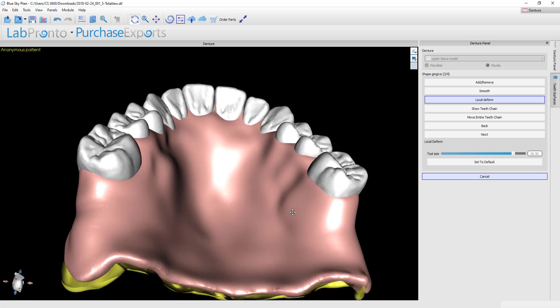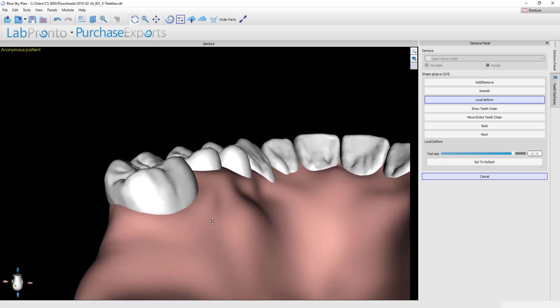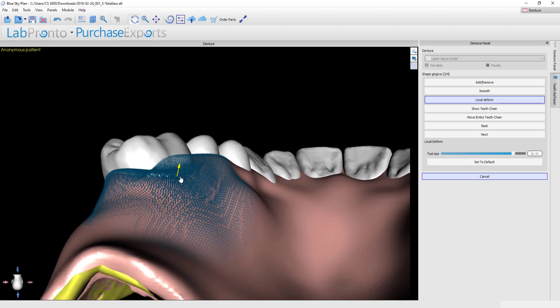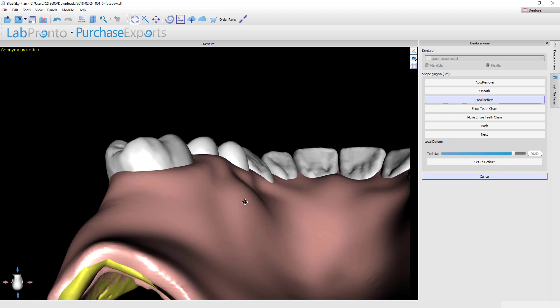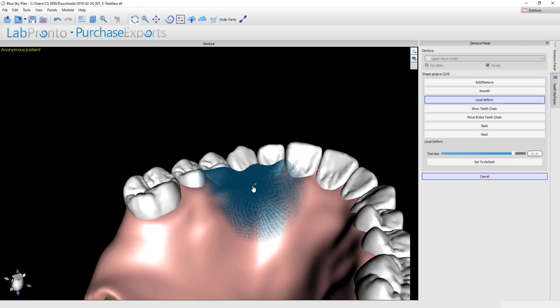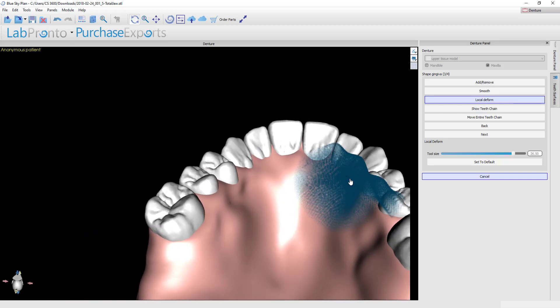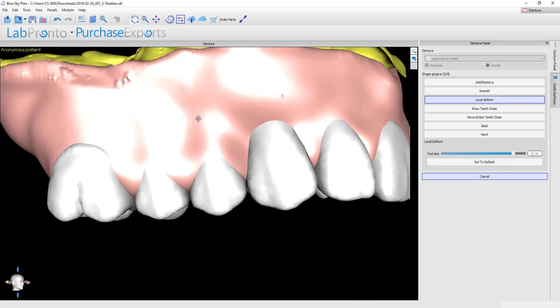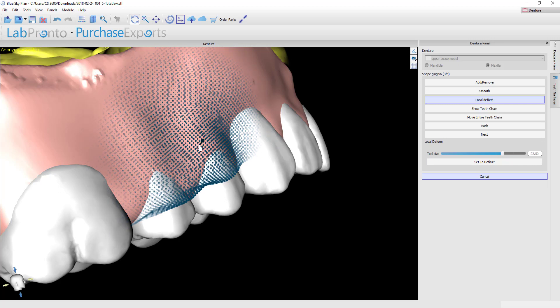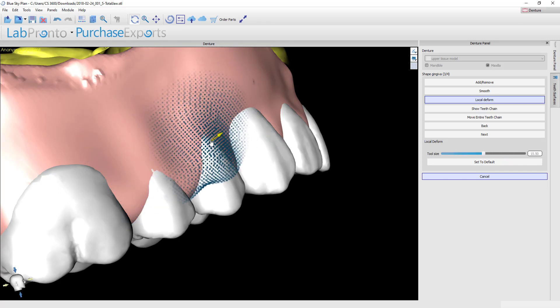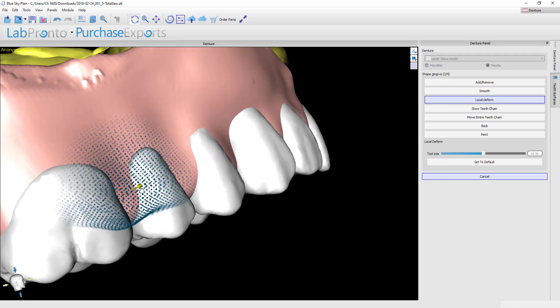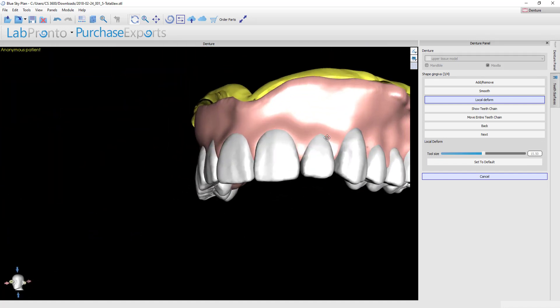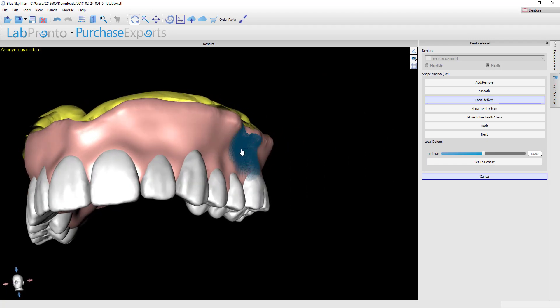If I've got any areas where I'd like for the gingiva to come up on the teeth further, I could grab those and bring that up quickly. This canine could stand to have a bit more gingiva on the lingual, same with this one. Conversely, you can use this to remove material as well. If I look at the buccal here, we still have too much gingiva on these premolars and I'm just going to bring that back. It looks like there's a bit of a caved-in area right here, so I can stretch that out slightly.